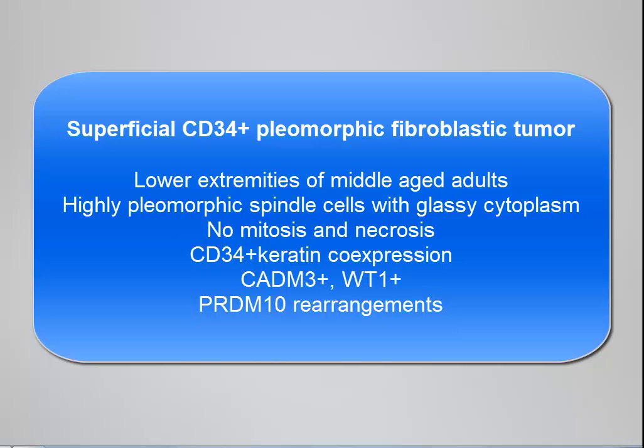This case is really a nightmare, let's say, because it expresses keratin, but the morphology is important. We have so much pleomorphism but lacking necrosis and mitosis, which should make pathologists think of this very special tumor.